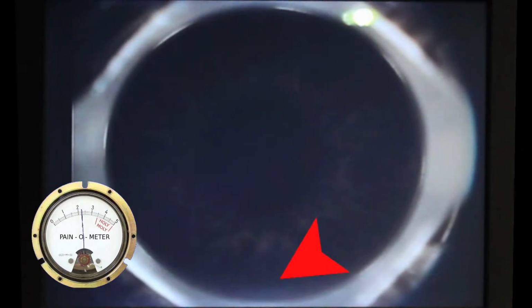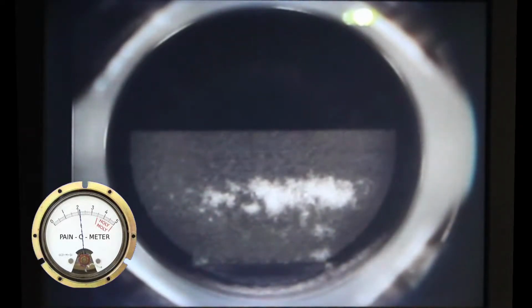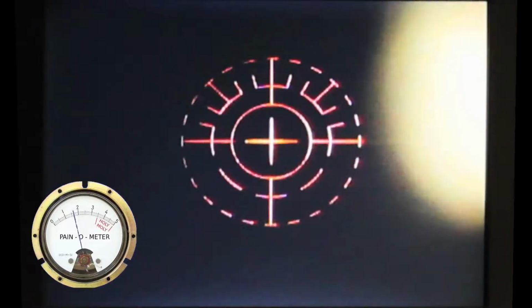Well, here the flap starts. You'll notice the laser cuts a flap, but it has a little anchor tab at the top here that doesn't cut all the way through, but then the laser cuts all the way across your eye. Is that rad or what? So it's a three-dimensional cut, so it's cutting like a hemisphere, and then once it cuts the whole tab, then it sears the edge right here. Isn't that awesome? That's the coolest thing in the world.